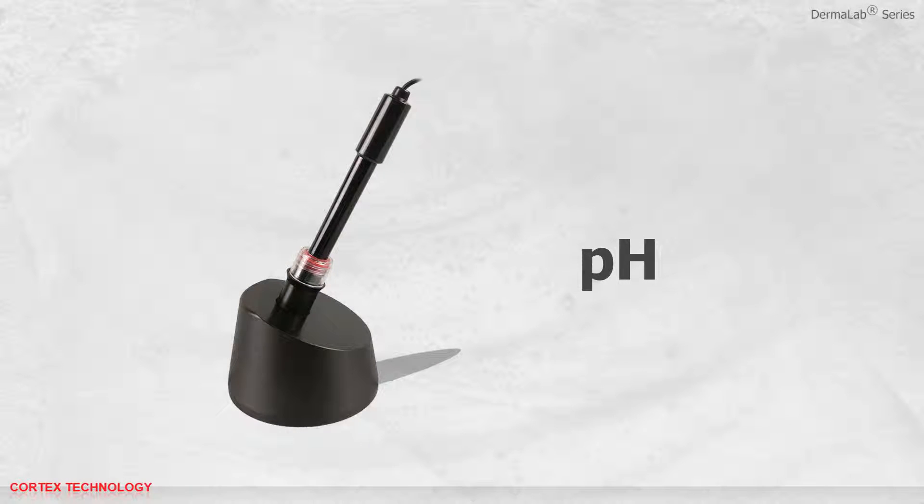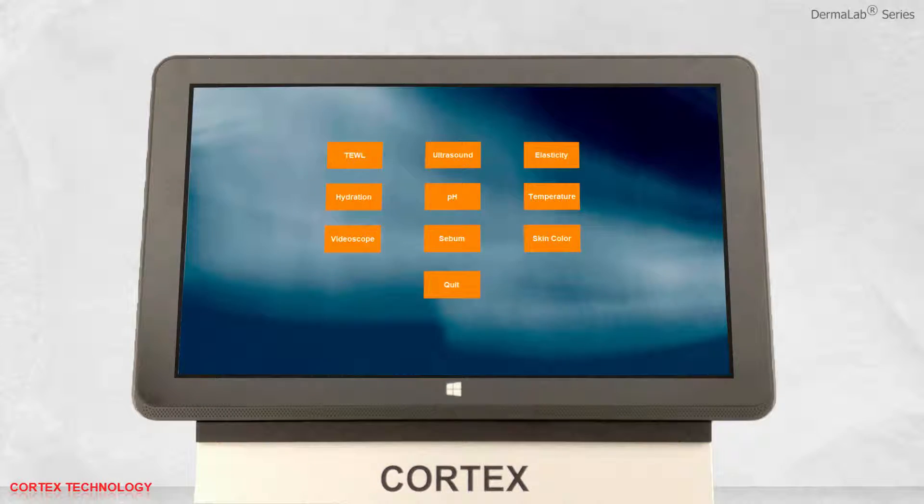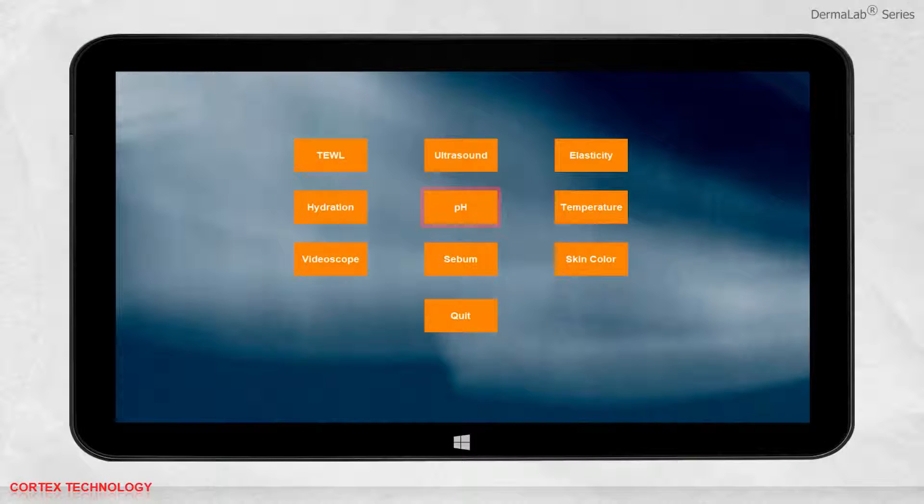pH application. Open the software and select pH.